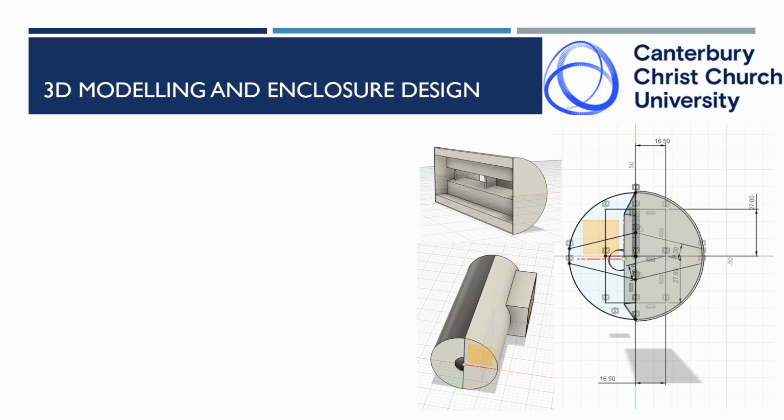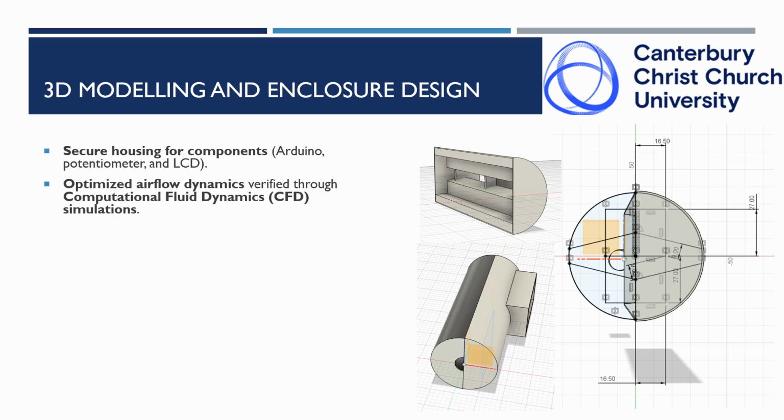Now, we come across the 3D modeling and enclosure design. The spirometer's ergonomic enclosure was designed in Autodesk Fusion 360 software in order to optimize durability, portability, and ease of use. The design considerations include a secure housing for components such as our Arduino Nano, our potentiometer, and LCD display. It has optimized airflow dynamics verified through computational fluid dynamics (CFD) simulations.